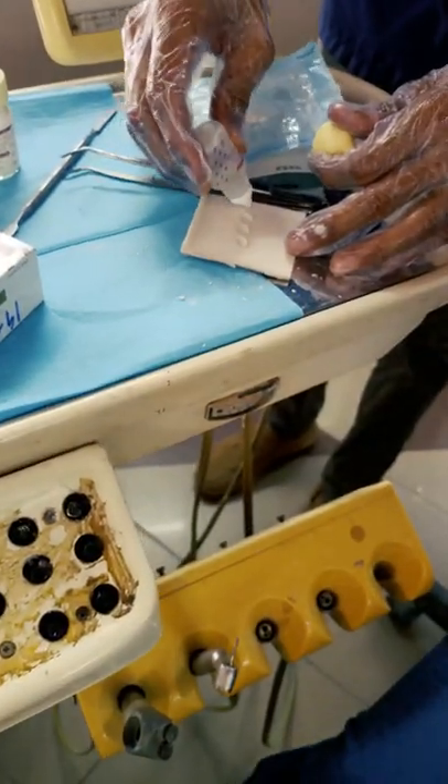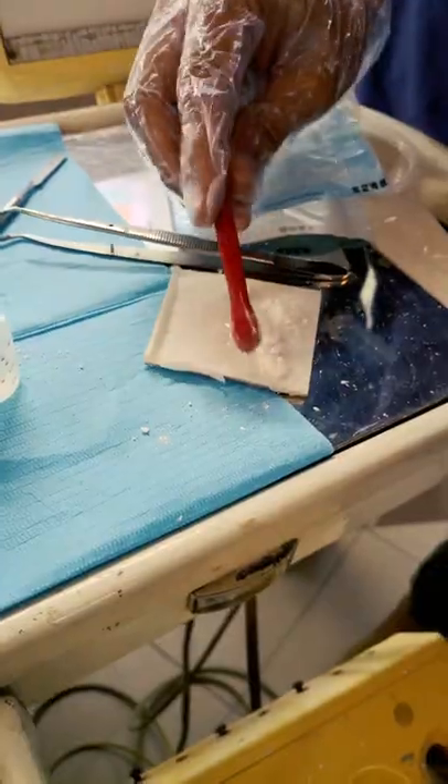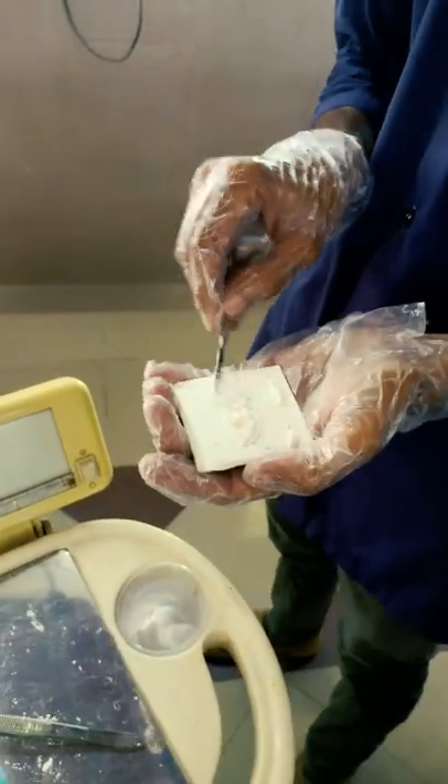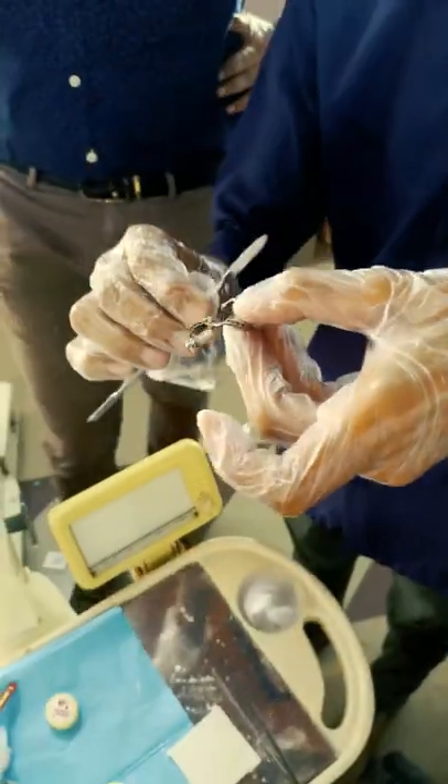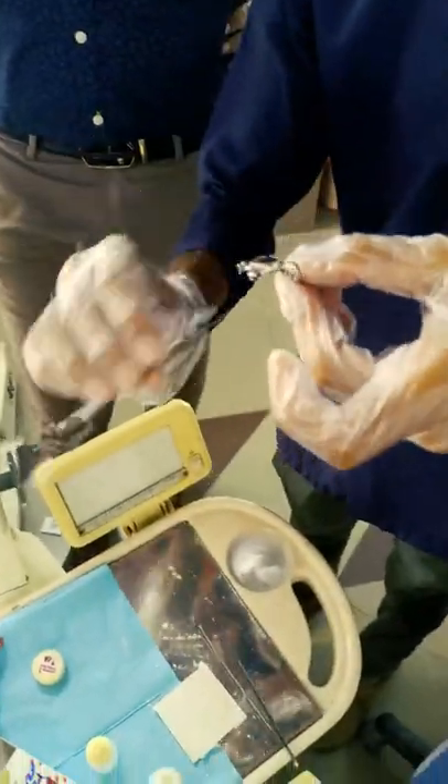To attach the Hyrex, we will use glass ionomer cement, otherwise known as GIC, and mix it in the recommended powder-liquid ratio. After mixing, we will apply the GIC on the four bands of the Hyrex.